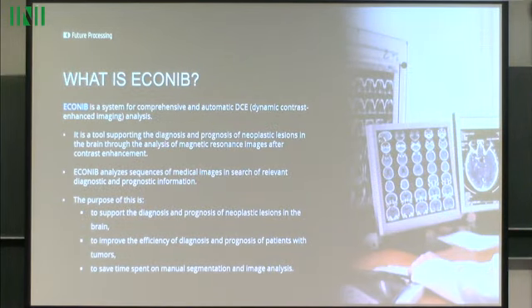If we look at dynamic imaging, we will see that it's already being analyzed, so there are some steps to be performed and we know actually all the steps. So why not automate the steps and make the life easier for clinicians or for the medical physicists that actually do that kind of processing. We started from the original MRI scan, and we want to produce the final report which contains the numbers. So we want to somehow quantify the contrast flow within the tissue of brain, for instance, or any other organ. That was the idea, because we want to develop the technology to be able to solve that kind of problem.